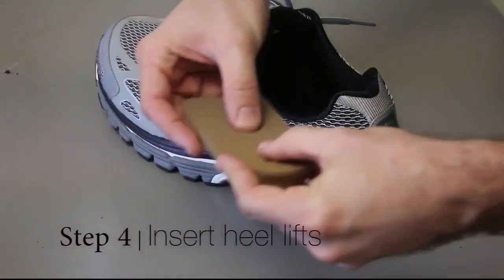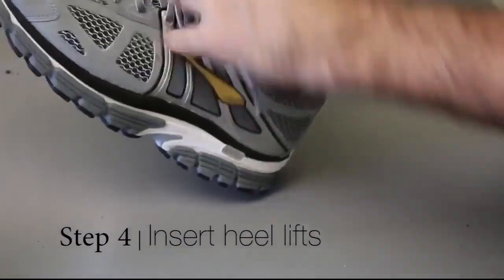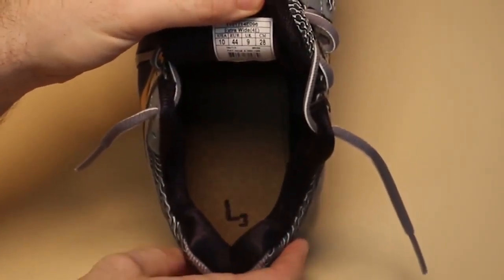Step 4. Heel lifts are labeled right or left with a number. With the toe pointed away from you and up, place the heel lift with the writing face up and the curved edge of the lift matching the contour of the heel portion of the shoe.